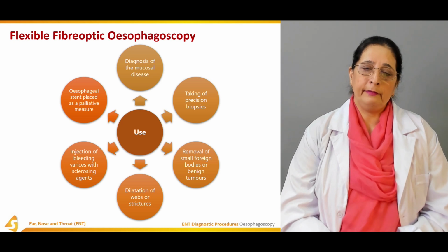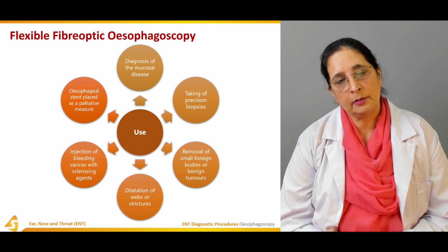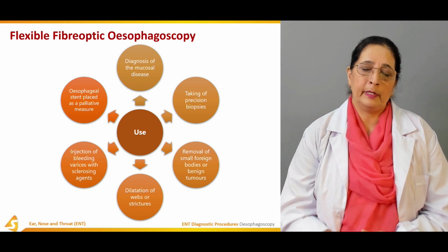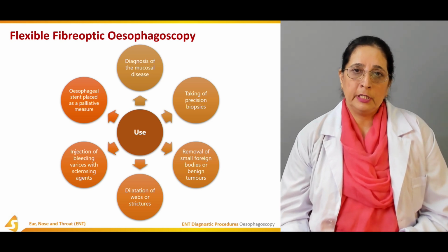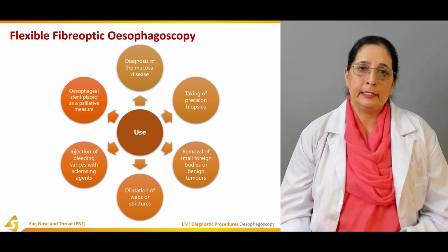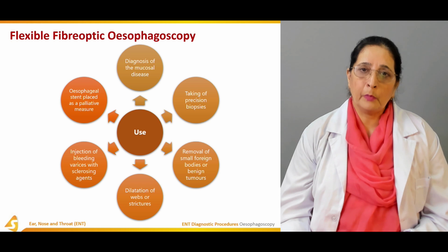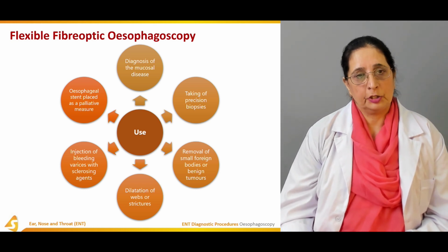So all these are very important indications for flexible fiber optic esophagoscopy. Strictures of the esophagus are common and can lead to dysphagia; those need to be corrected. Dilatation is done, biopsies can be performed, foreign bodies can be removed.